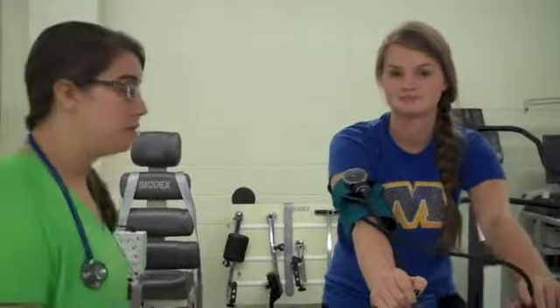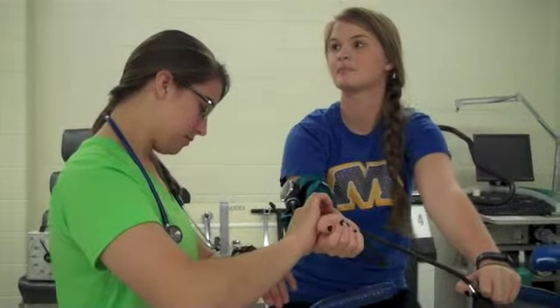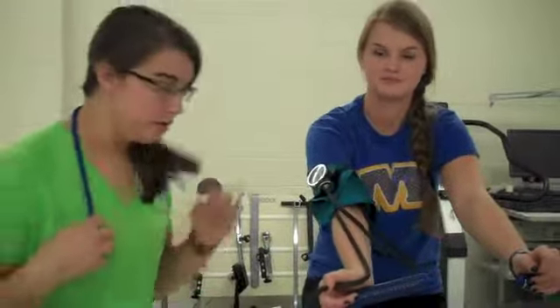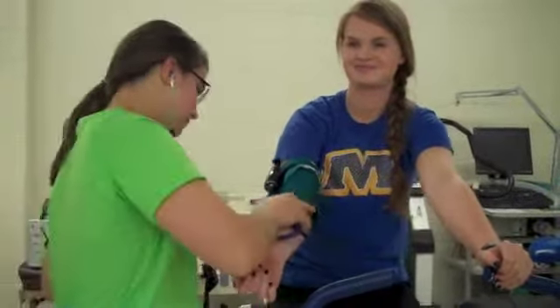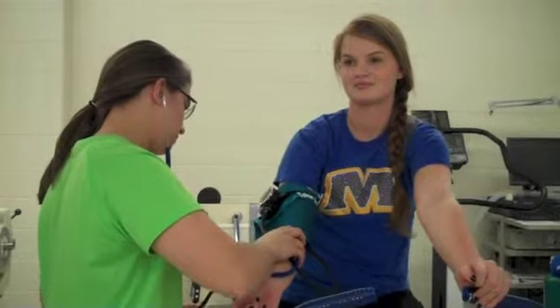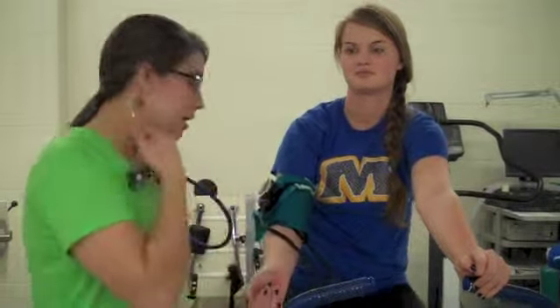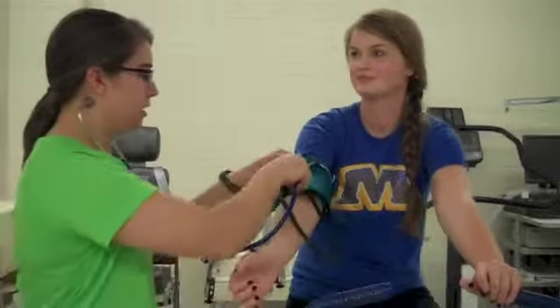So Ashley has been cooling down now for about 2 to 3 minutes. I'm going to go ahead and check her heart rate and blood pressure, and then we'll get her off of the bike. Ashley's heart rate right now is around 100, which is normal because she's cooling down. Ashley's blood pressure is 128/82, which is normal because she's cooling down, so her heart rate should be coming down as well as her blood pressure. So Ashley, we're going to go ahead and stop the test.